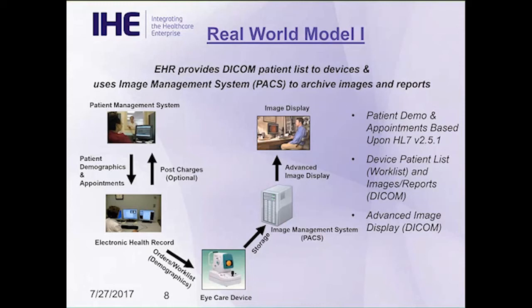And so the IHE device then uses DICOM to actually transmit their output data, whatever it happens to be, in different types of images, to an image management or PACS system. And then they take responsibility for storing the data, and they also have the ability to connect to display systems, which can pull that data, query it, display it, and view it for the doctor.